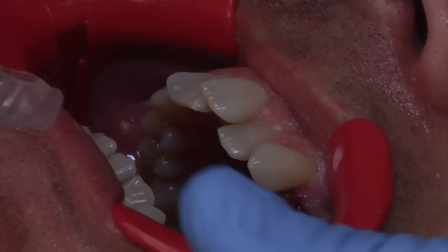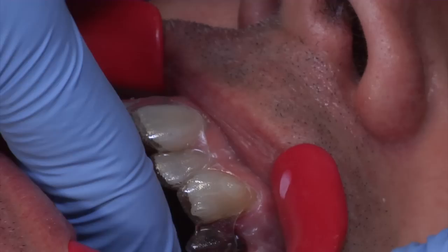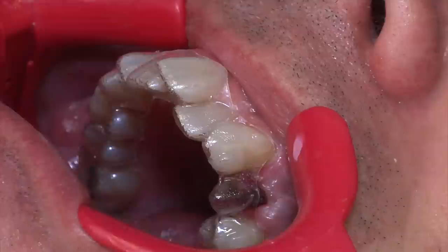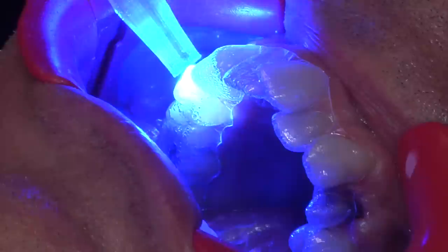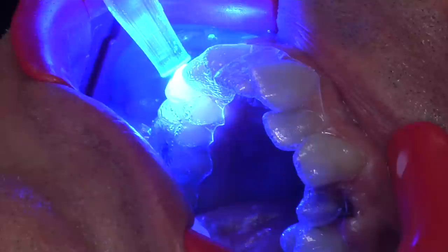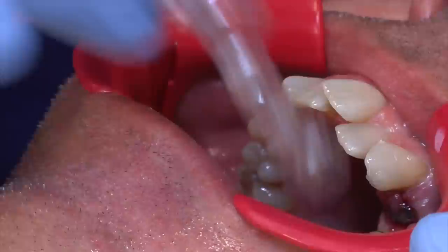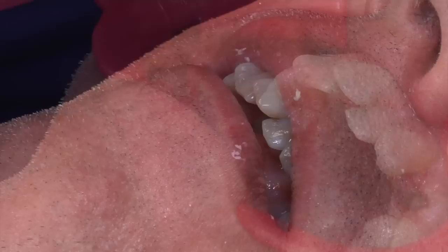So we're ready to insert the top aligner. All the glue is loaded into the attachments and we're going to insert the tray, making sure it's a great fit — pushing down everywhere on the biting surface of the teeth. Then we're going to take our light and harden all the glue with about a 10-second cure on each attachment. Now that we've cured all the top attachments, we're going to remove the tray by gently lifting it up. And all the attachments are placed.